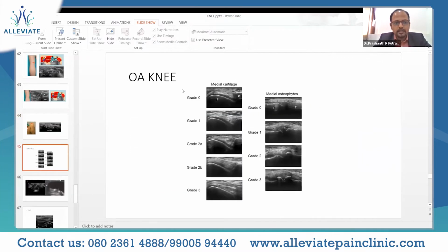Finally, the last slide of my presentation, again what I spoke about, the evaluation of the medial articular cartilage. As you can see, it is graded accordingly. Normally we depend upon the X-ray, and there can also be a sonographic classification of the stages of osteoarthritis as well. Okay. Thank you.